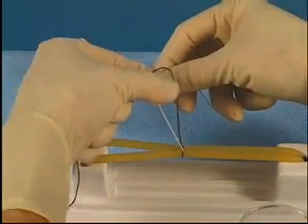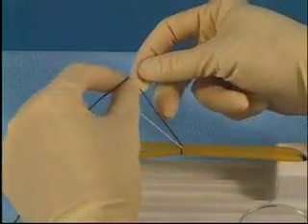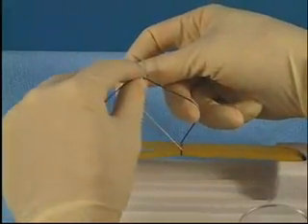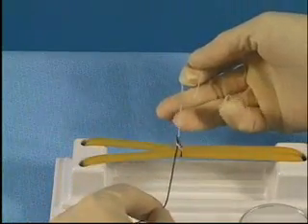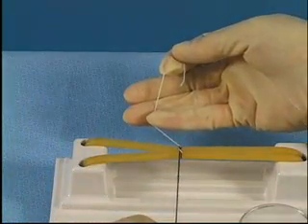rotating the finger and thumb through the loop, grasping the suture material, and completing two throws.